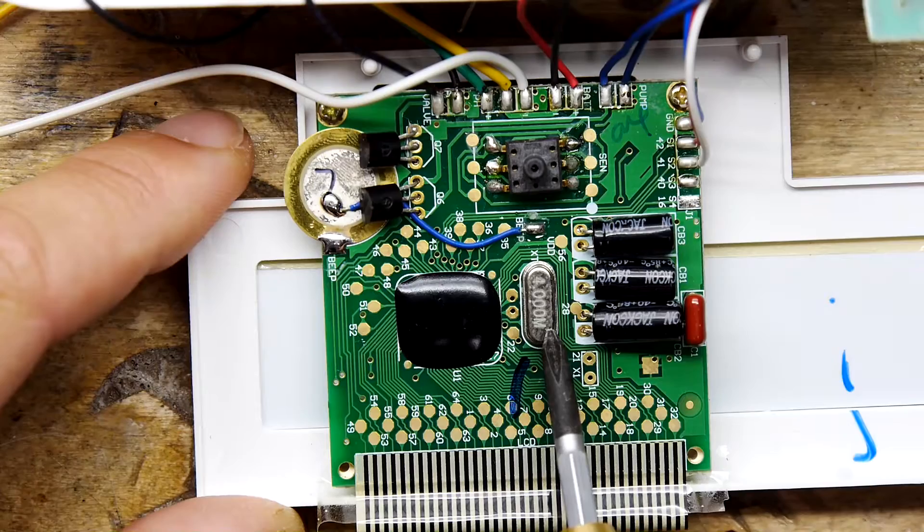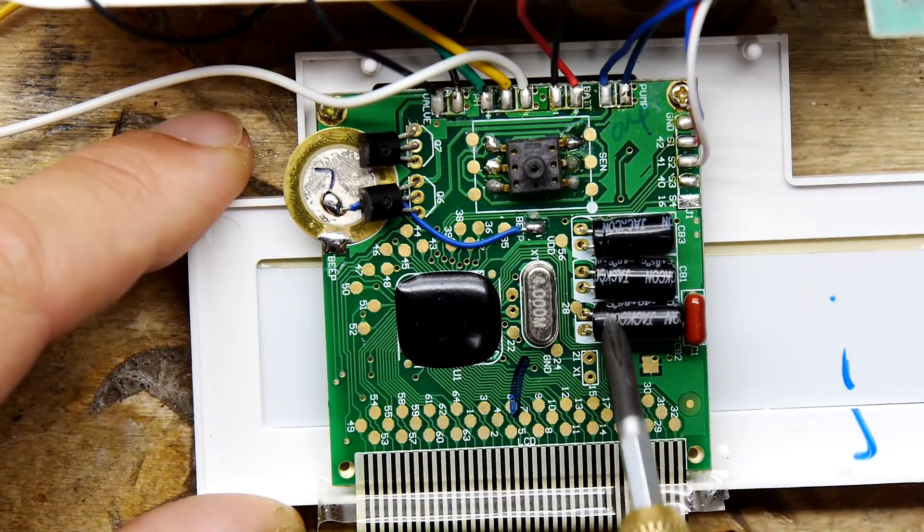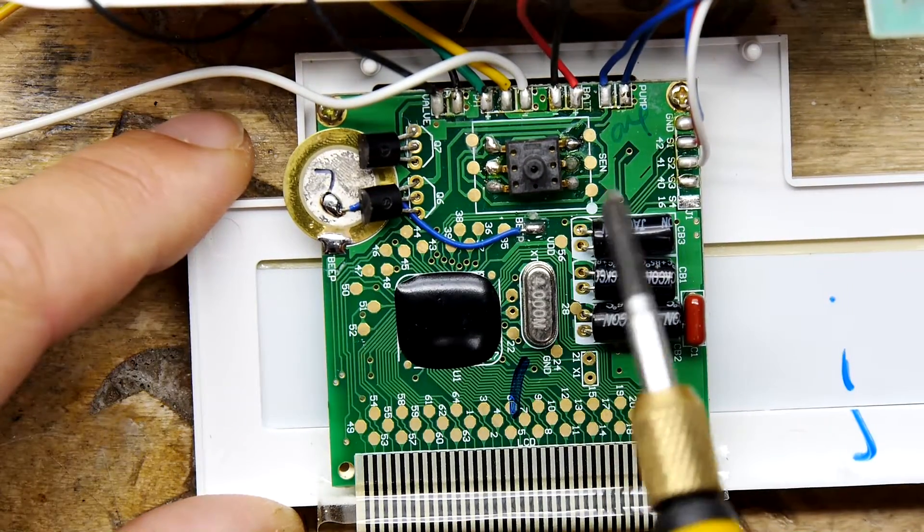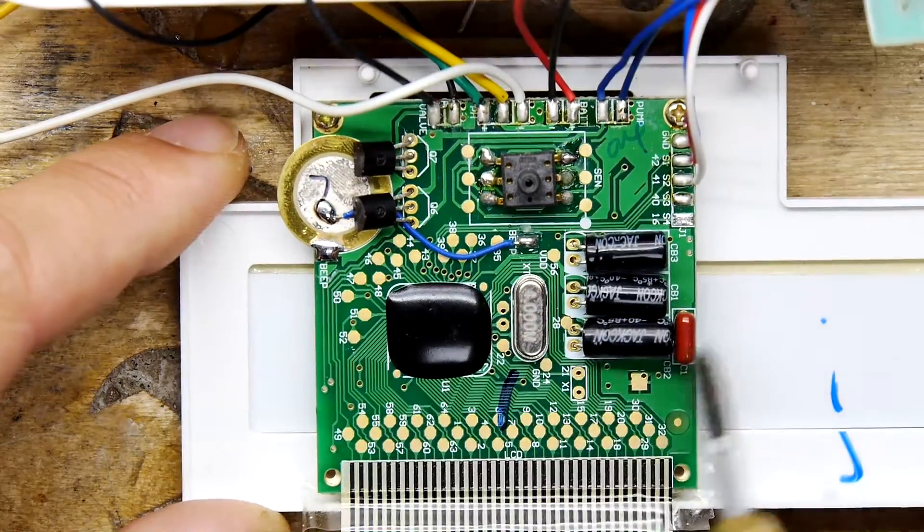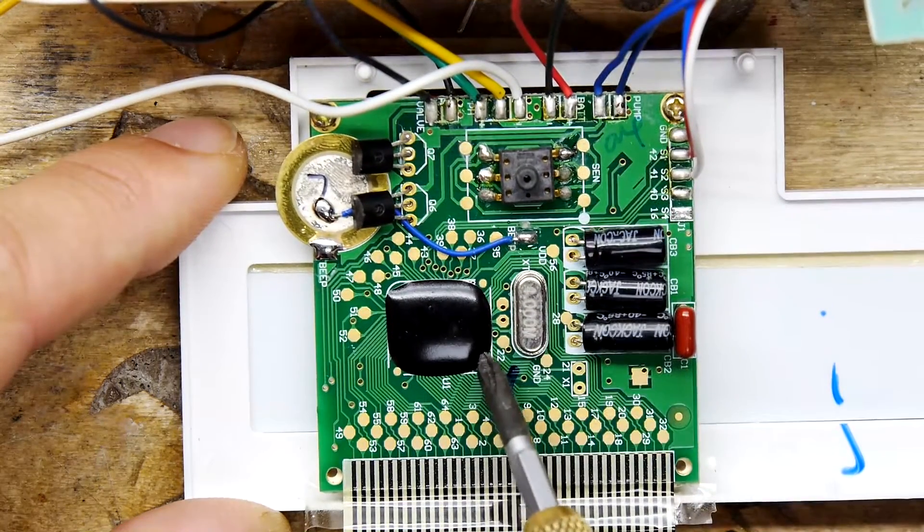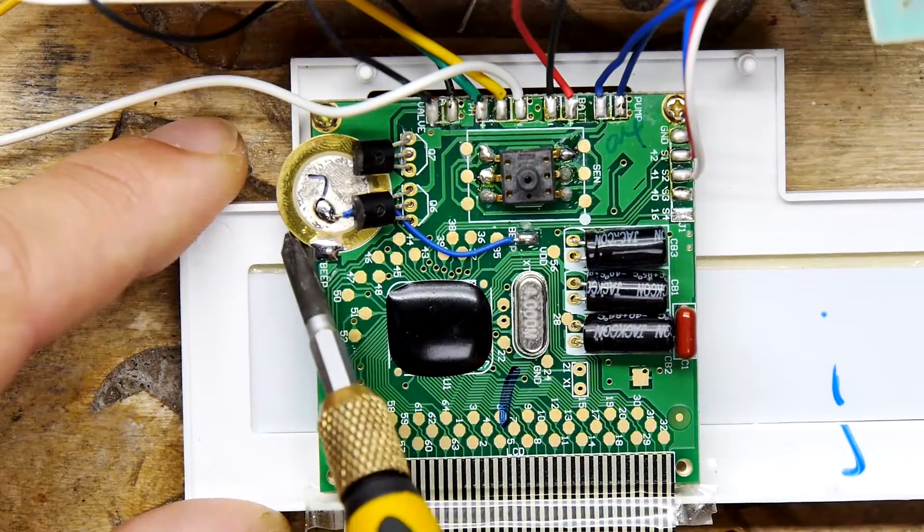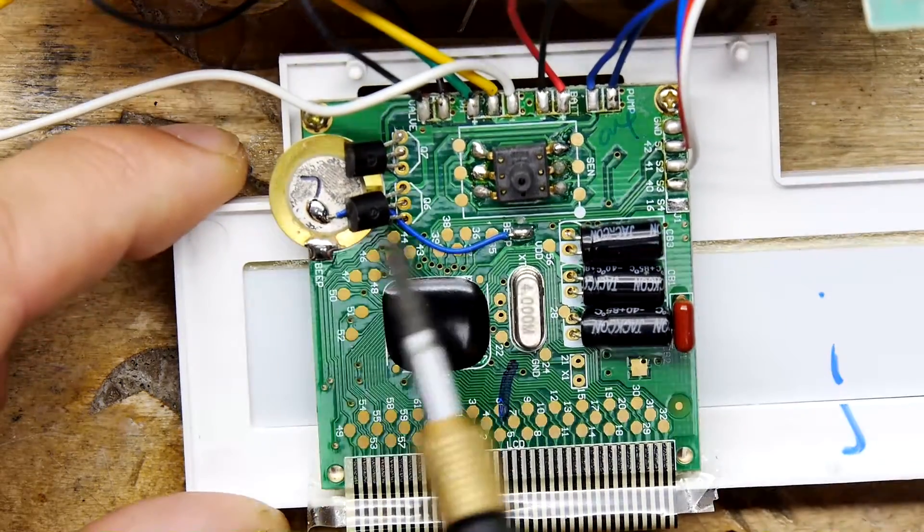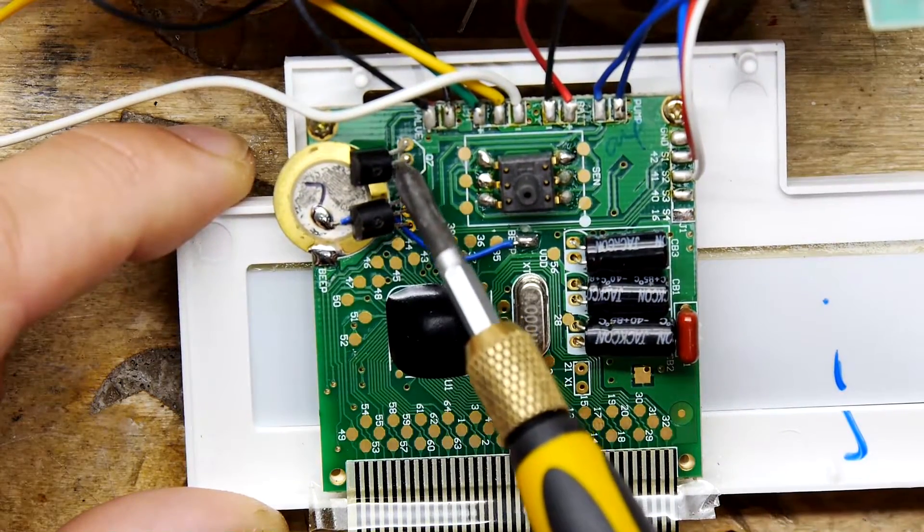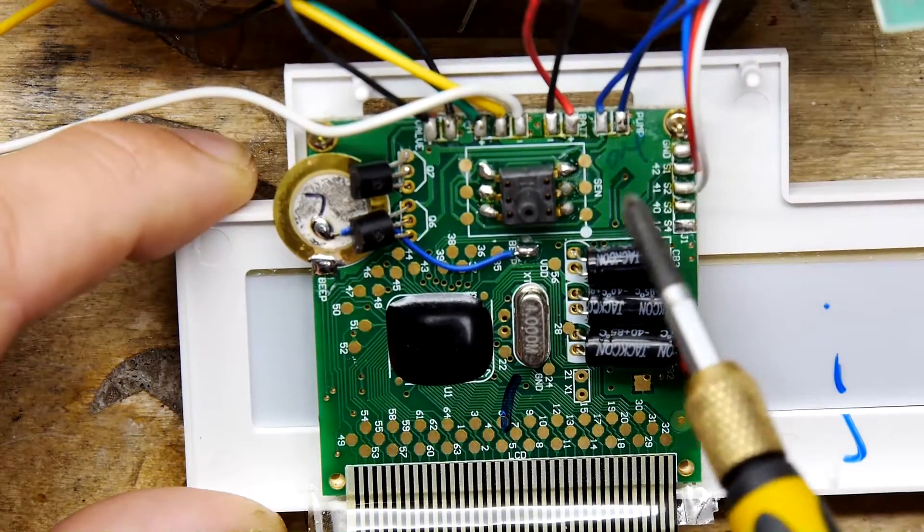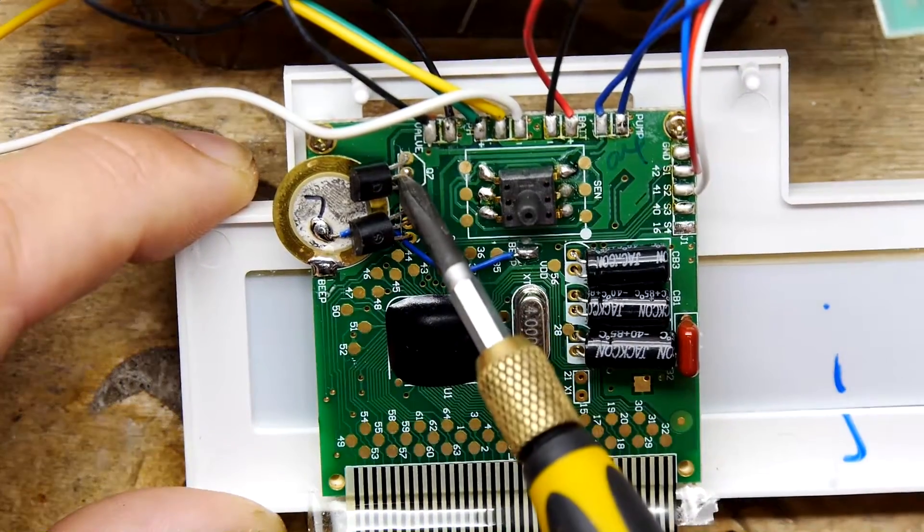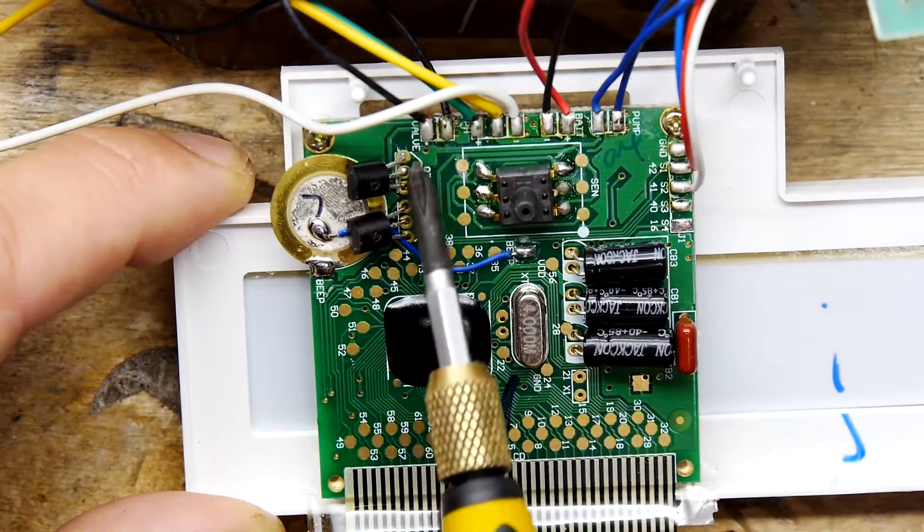So you've got four megahertz crystal. You've got a bunch of caps here, probably to deal with the actual solenoid firing. So you don't have this thing browning out and resetting itself. There's your buzzer. And you've got a couple of transistors here, probably one for the motor and maybe one for that dump valve thing.